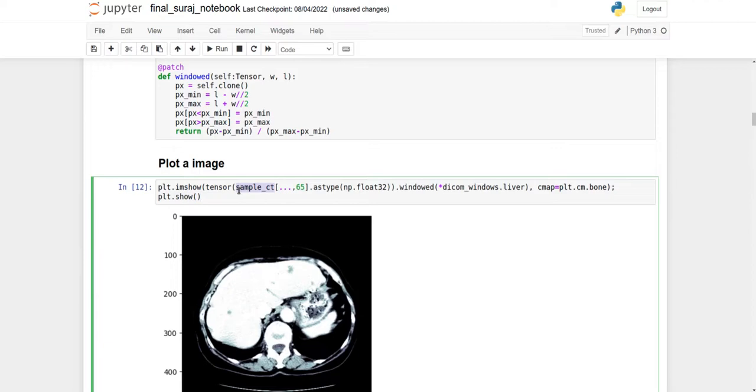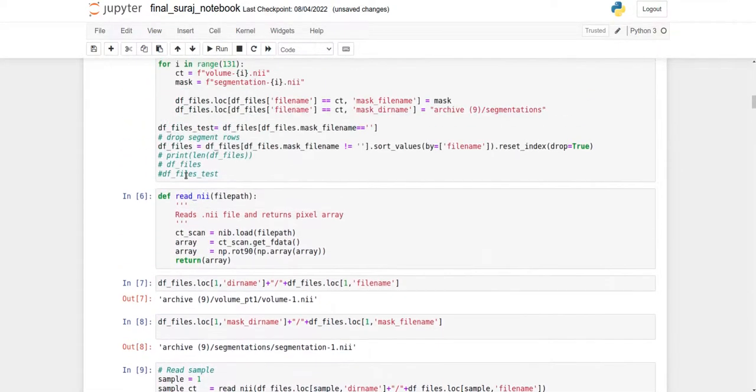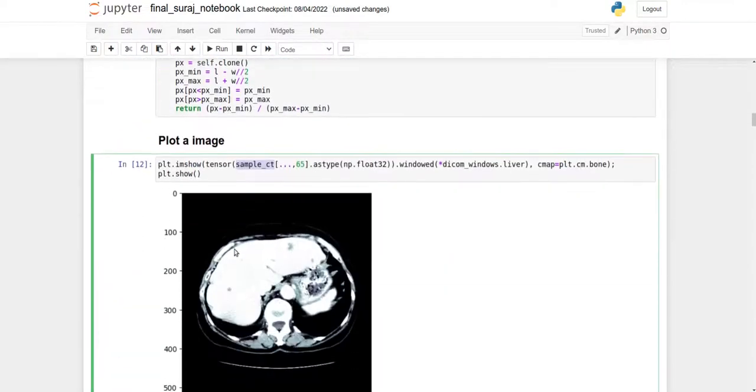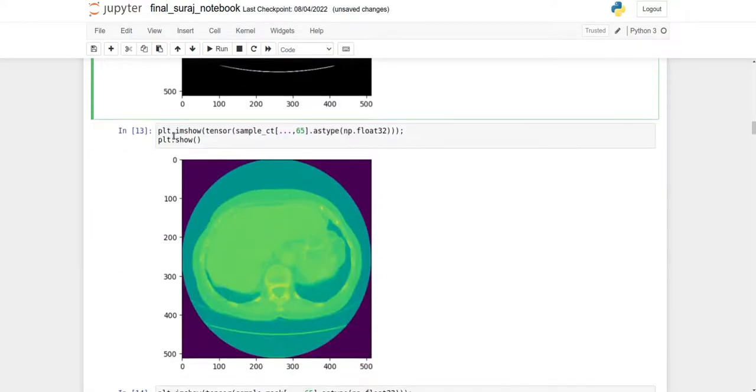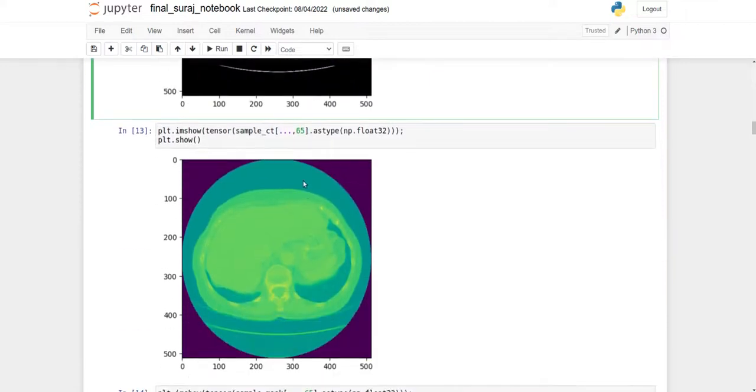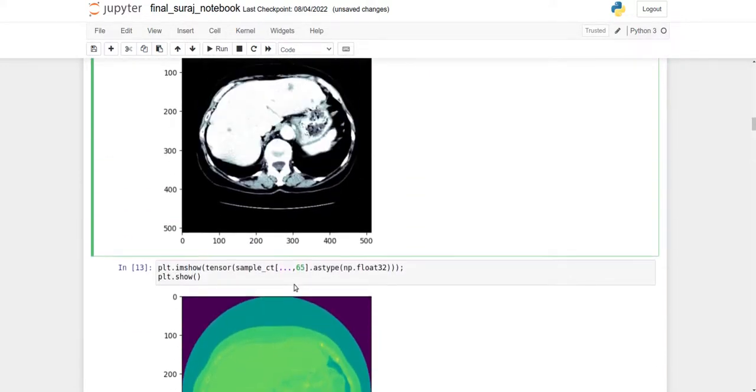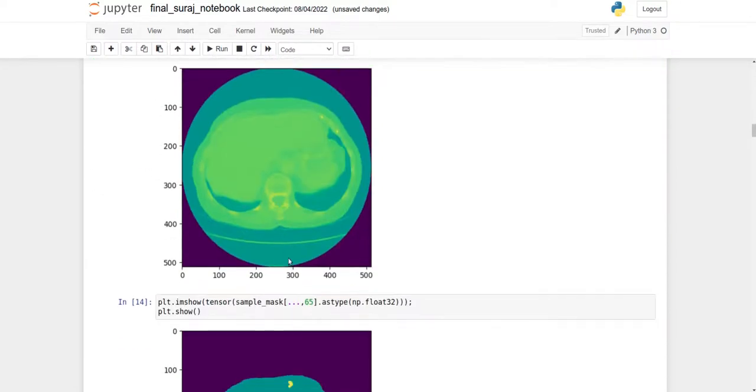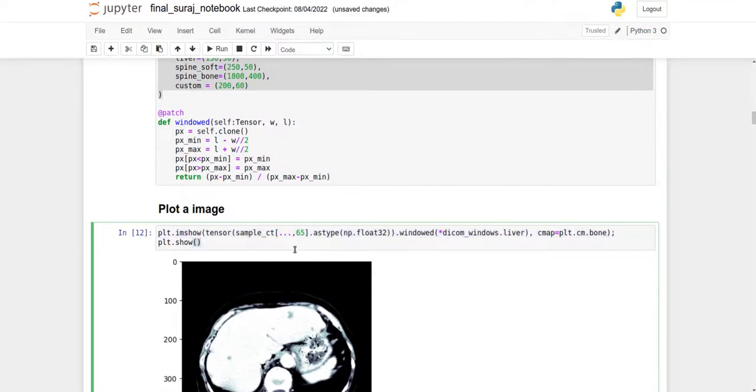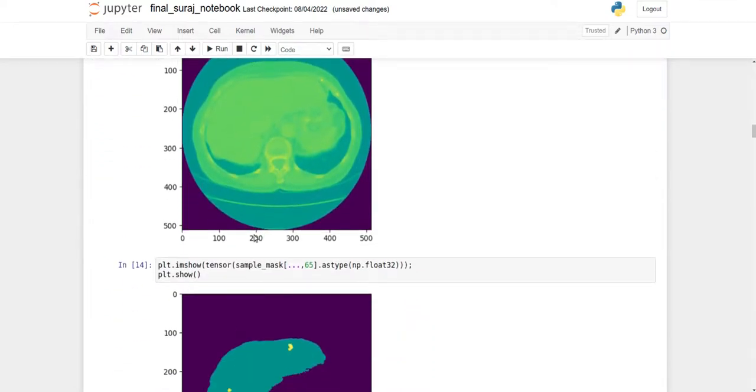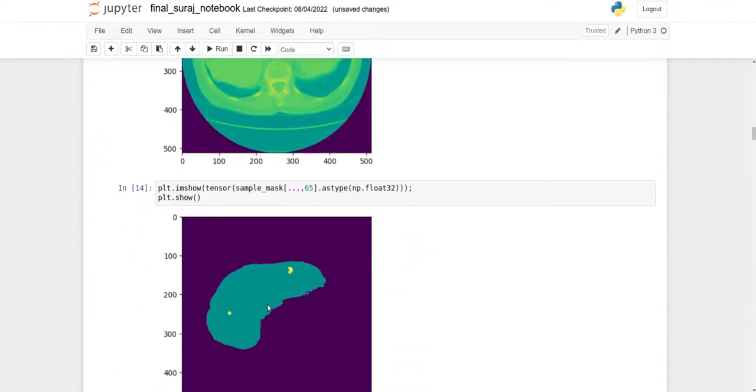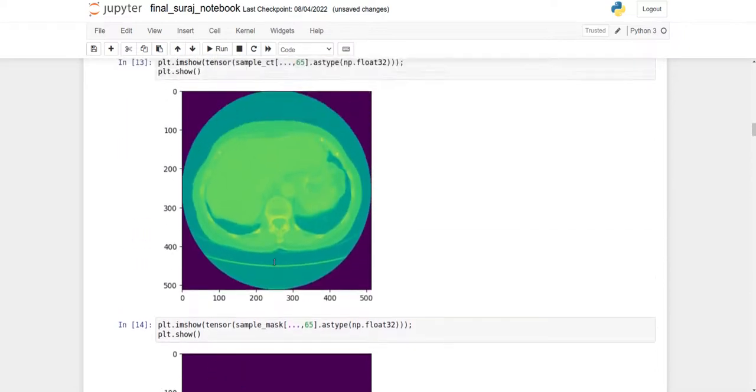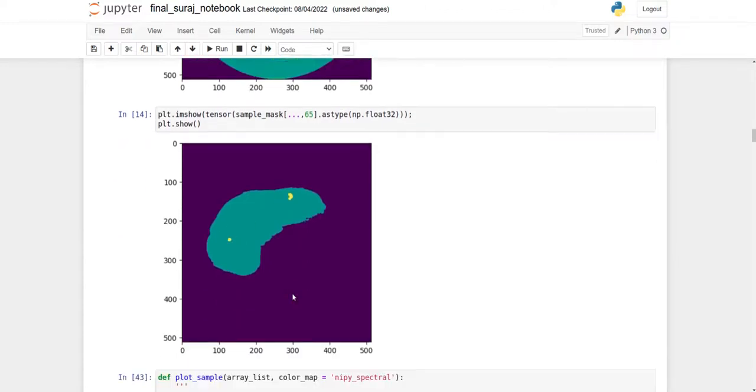These are custom preprocessing functions available in FastAI for liver segmentation. After reading the image with the custom NIfTI reader and applying preprocessing, the original images look like this. You can see the clarity improvement - now you can see the liver part clearly. There are multiple slices, so we're converting these 3D images to 2D first.